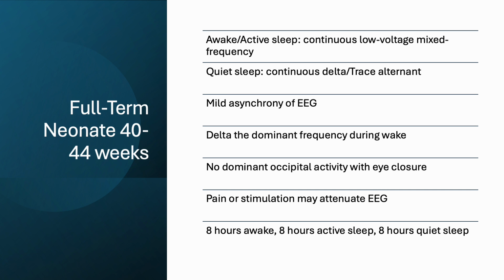Also, even though the corpus callosum is present, the two hemispheres of the brain are still trying to connect to each other, and for that reason we see some asynchrony in the EEG. The waves won't line up with the other side of the brain yet.